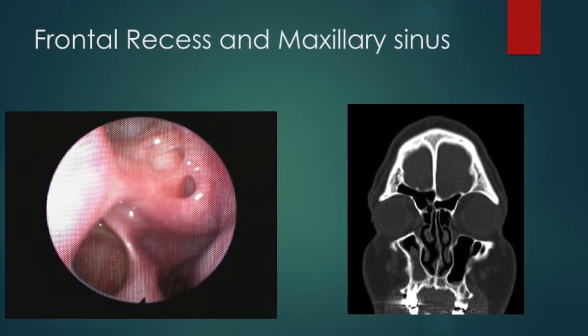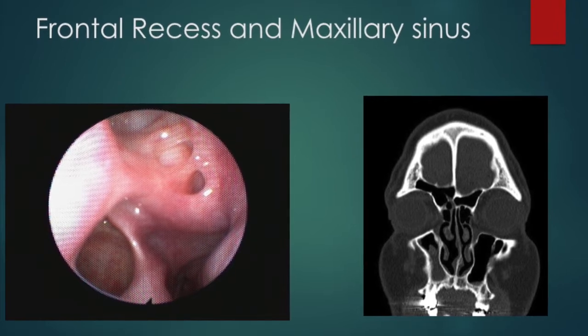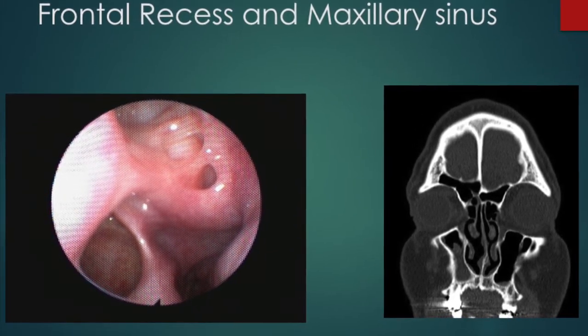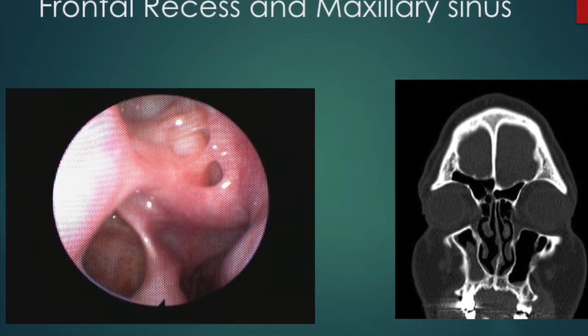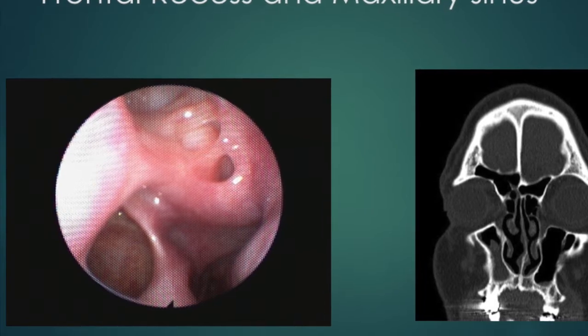Now here's just another view, and it's a little bit further back. This is that same maxillary sinus, and we're looking up into those ethmoid sinuses between the eyes. And so you can see how it looks kind of like a honeycomb. You don't have to take all the bone away, you just take enough so that these will crack. And just to refresh, this is the frontal sinus, the back part of it where it's kind of getting smaller. That's an outflow tract. Here's the maxillary sinus, and here's some of the ethmoids. Next.